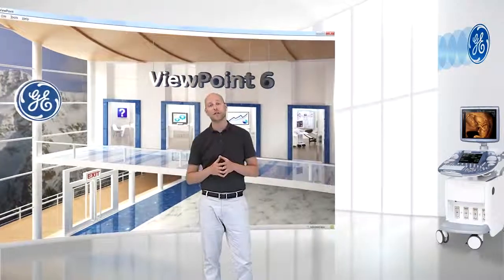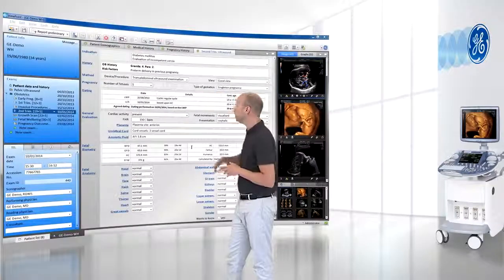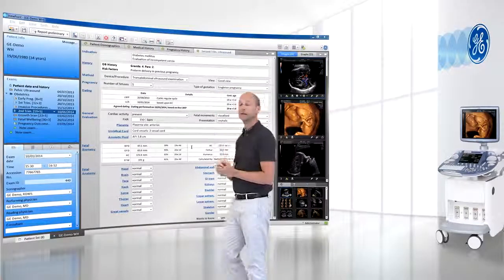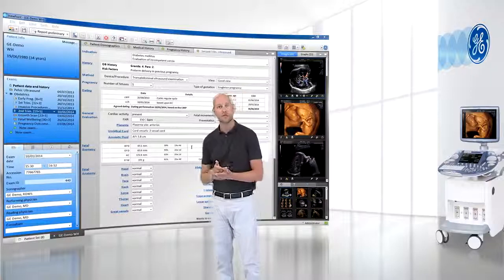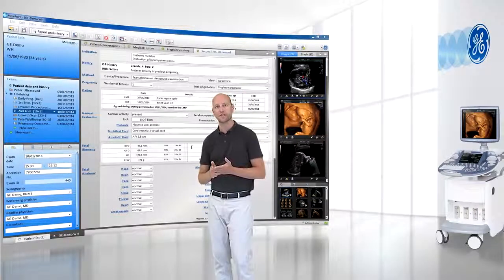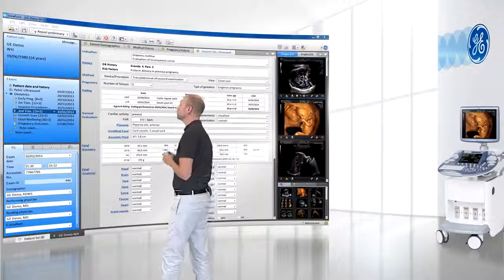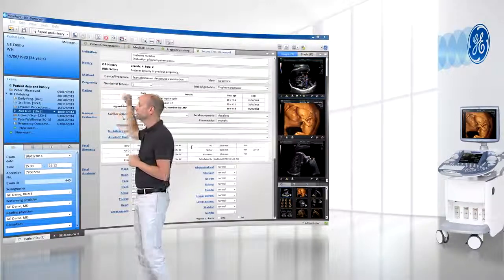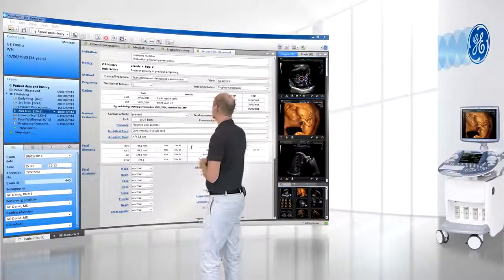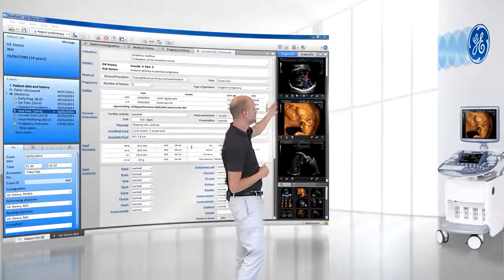Designed based on your feedback, Viewpoint presents all your ultrasound information in one view in an intuitive, easy to use, and clearly structured interface that provides you quick access to patient history, reports, as well as your images.